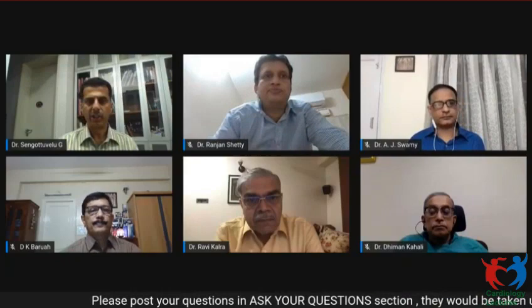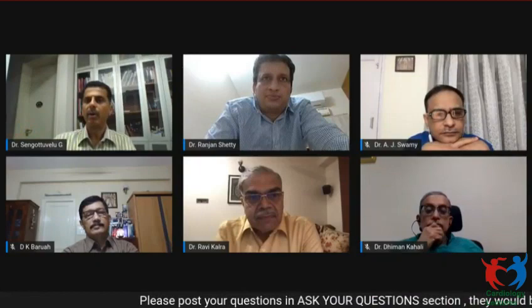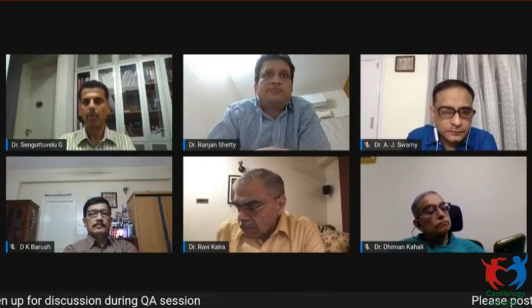I'll start with Dr. Ranjan. Dr. Ranjan, about DK crush, when do you think operators should start doing DK crush? And as Dr. Ajay pointed out, the crossing should not be a distal crossing. The distal crossing is very important when you do a provisional, particularly for a T-tap or a culotte. But for a DK crush, we don't advise distal crossing. Can you tell us more about a DK crush and how you do it?